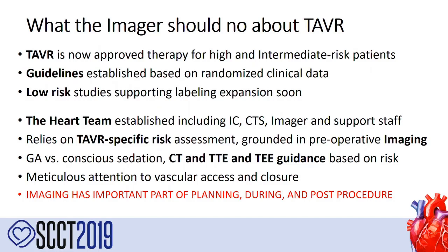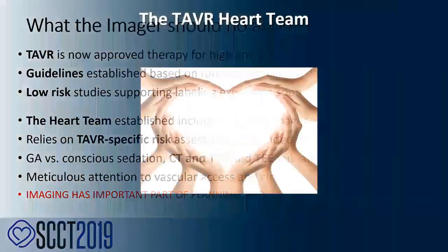Now, we can do general anesthesia, we can do conscious sedation. We use CT for all the TAVR assessment, and TEE versus TTE guidance based on risk. And also, there is a meticulous attention to the vascular access and closure. So imaging has been an important part of planning during the procedure and post-procedure. It's really an integral part of TAVR today.